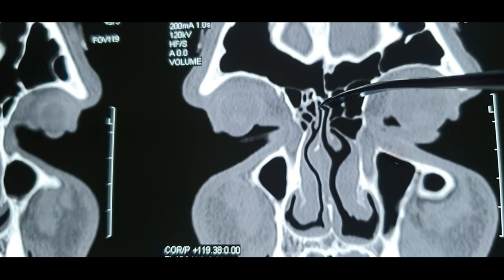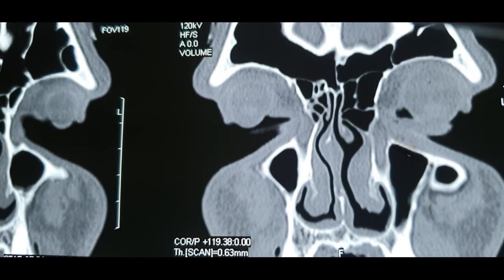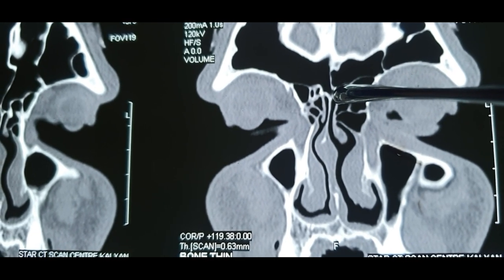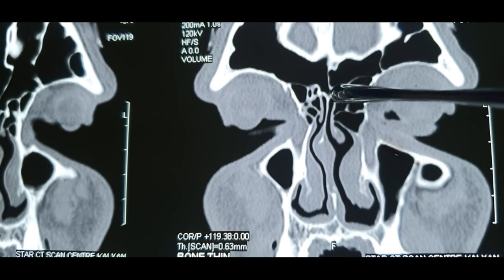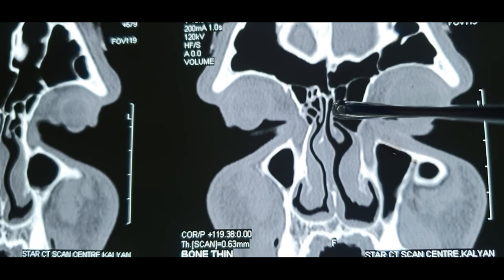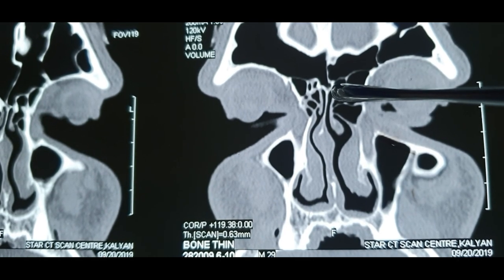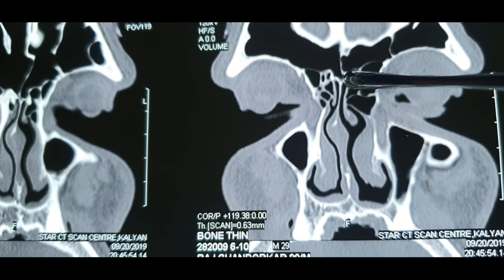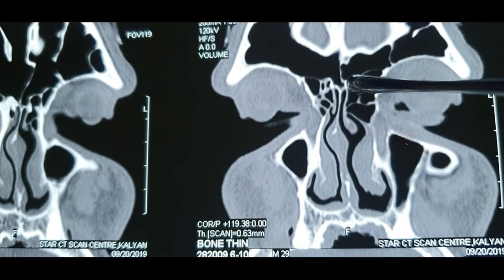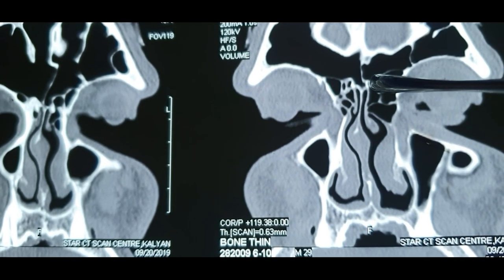See, this is the septum midline, and this is a cribriform plate. This is a middle turbinate. This is the medial lamella. See the pinpoint gap in between. This is a septum attached to the skull base, and this is a middle turbinate. You see that thin, white, bony septa in between those two, a small horizontal segment, that's the medial lamella of the cribriform plate. And you can see something vertical here, that is the lateral lamella of the cribriform plate. That is the most anterior aspect of the cribriform.